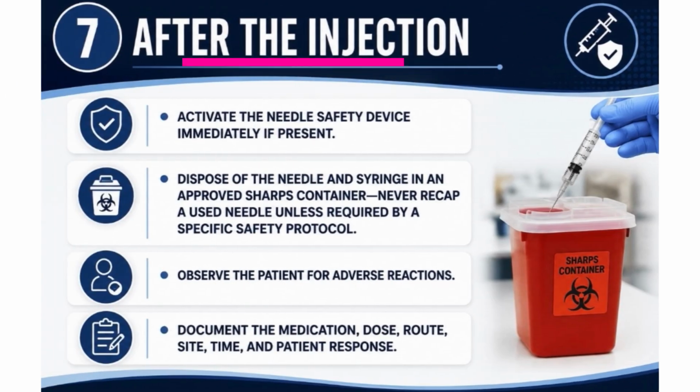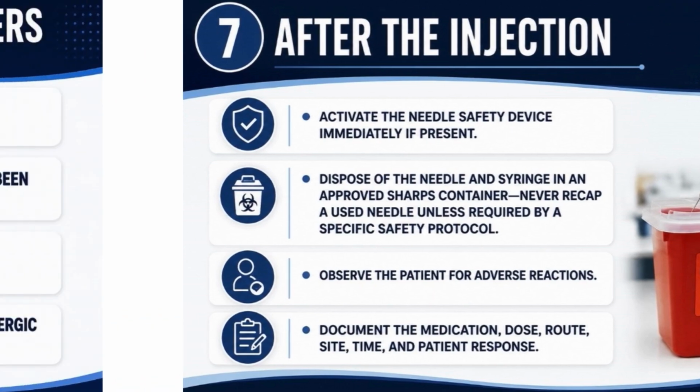Okay, and then after the injections, you want to activate the safety needle immediately, and never recap a needle. Activate the safety needle, and then you want to dispose of it into a sharps hazard container. And then you want to observe the patient for adverse reactions. Ask them how they feel, and then document the medication, right dose, right site, right time.